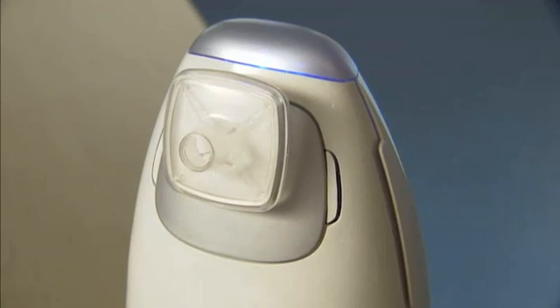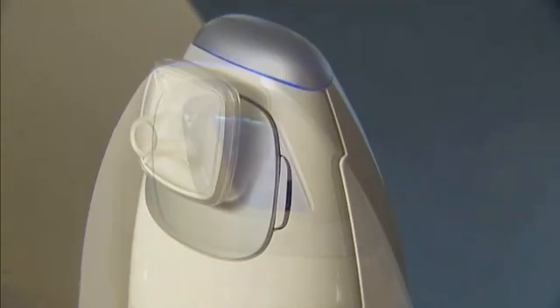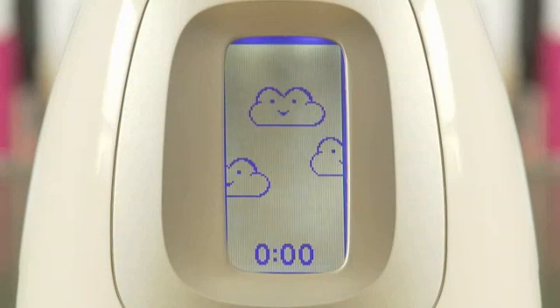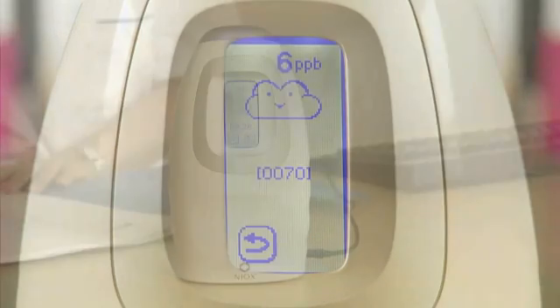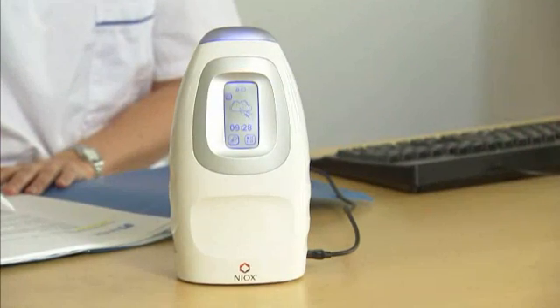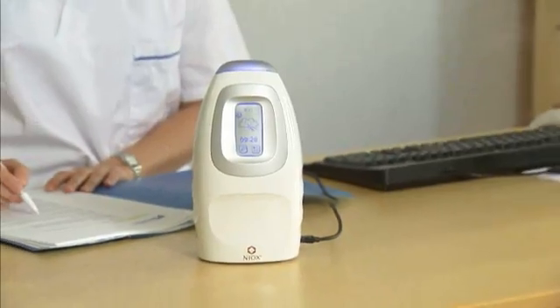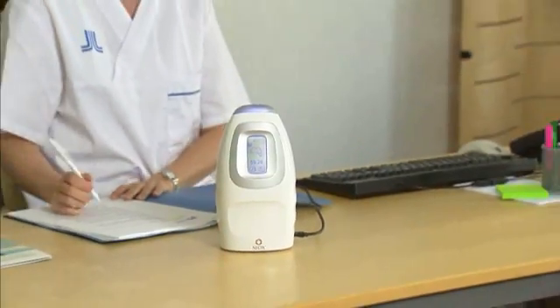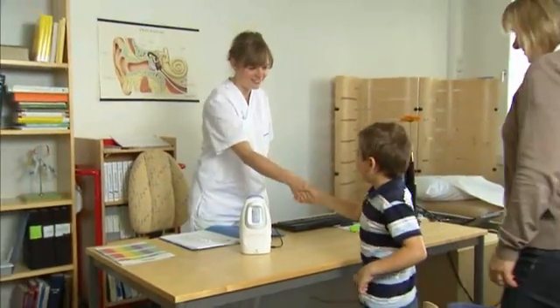is the only calibration and maintenance free device available for measuring exhaled nitric oxide. All values are quality assured, meaning that you get values you can rely on. This is extensively documented in a number of clinical papers.